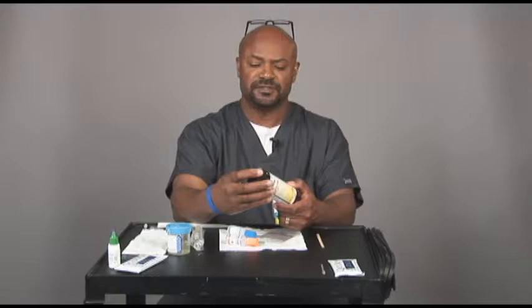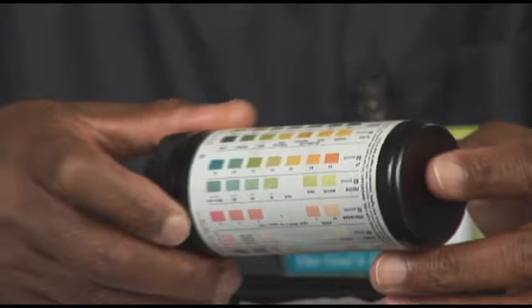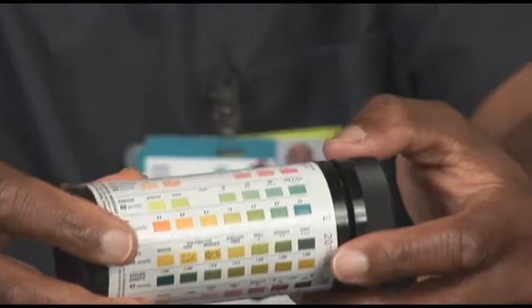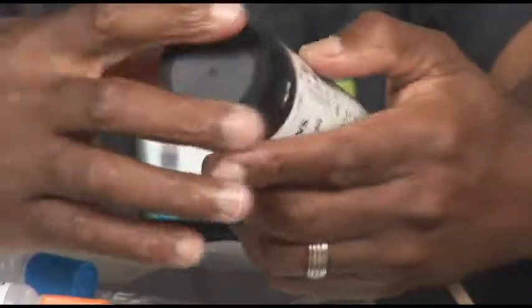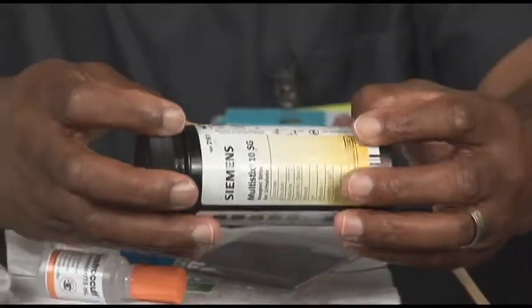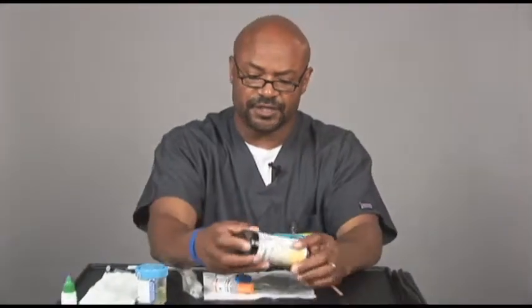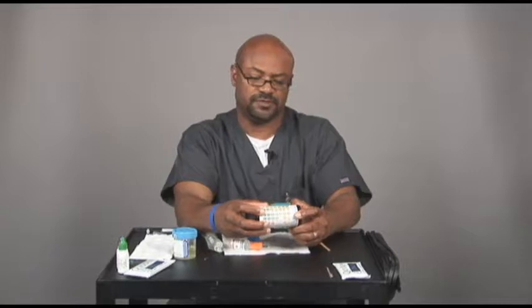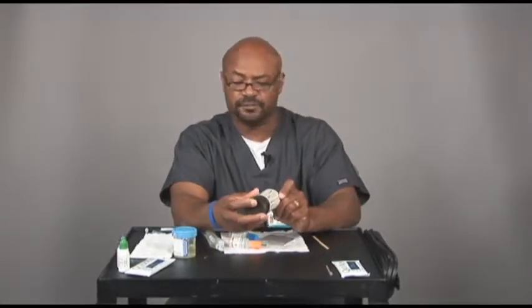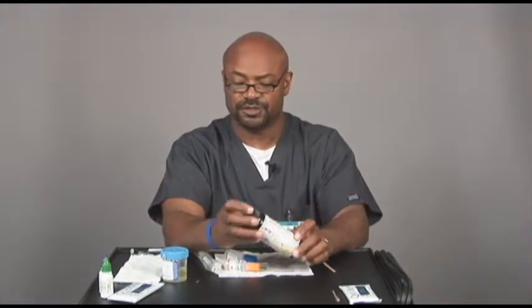First, we're going to perform the urine dip, which we use the Siemens urine multi-sticks, which comes in a multitude of colors that we measure. We measure things like urine glucose, leukocytes, specific gravity, blood, pH, protein, urobilinogen, nitrites. On each testable item, it has the time that the manufacturer recommends that you wait in order to record your result.